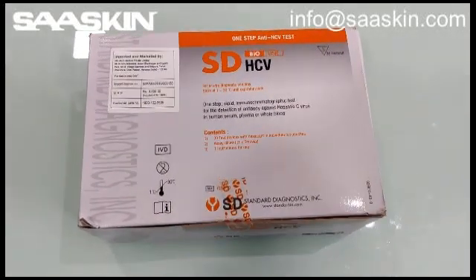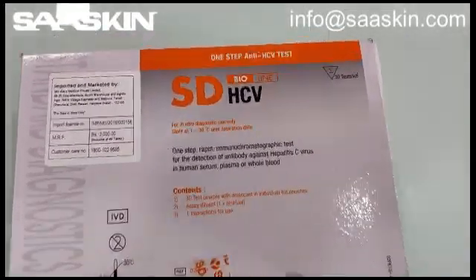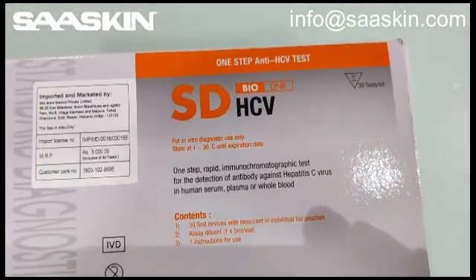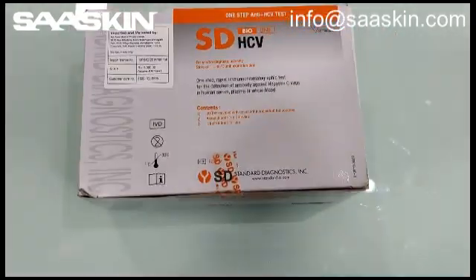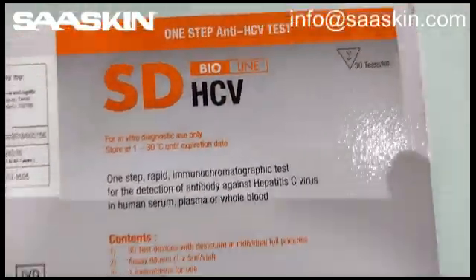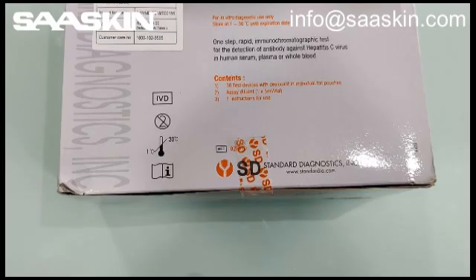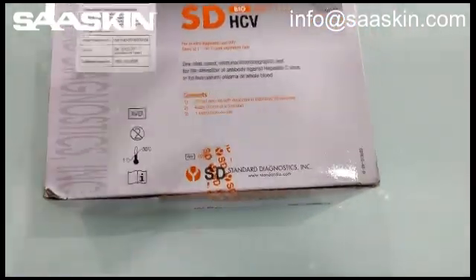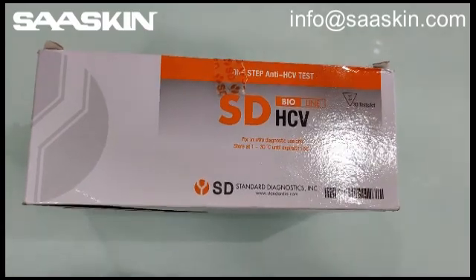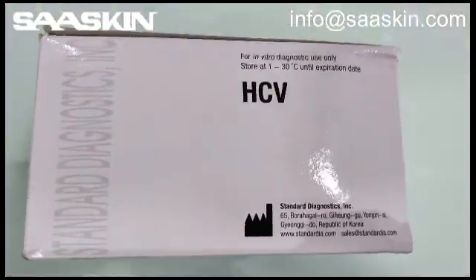I'm going to introduce you to another box, which is the SD Bioline Hepatitis C Virus Antibody Test Kit. Here is how it looks — let me quickly show you in detail. This is an IVD certified product. Let me show you all the sides of the box — this is how the box looks like.